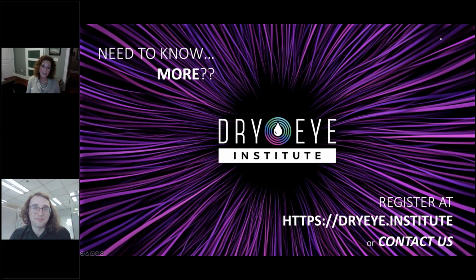Here's what I'll say to this for everybody else. Have it in the workup room so that it can be a mainstream screener. If you have it in a special area of the office, that's great for dry eye evals, but you are absolutely missing the boat by not being able to use it as a screener. But when you have your dry eye eval, you can't have it holding up the room that has the auto refractor and the Optomap and stuff in there. So that's where scheduling comes in.